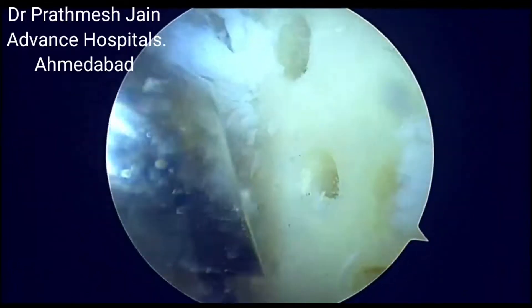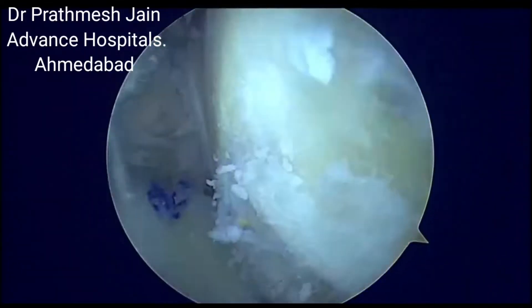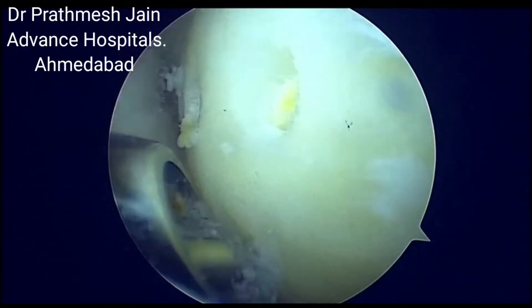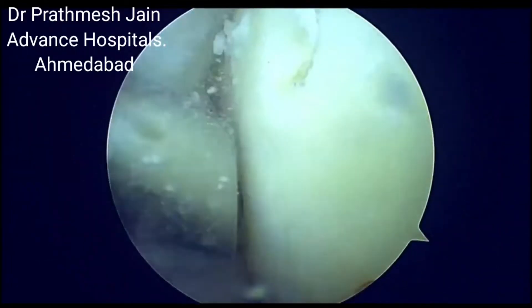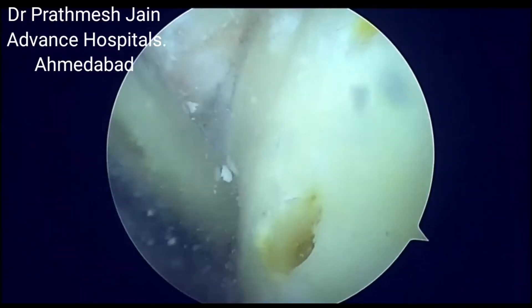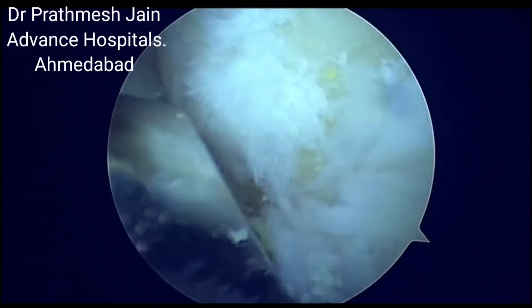This is an example of doing microfracture using the Striker special blade. What we are doing here is making small drill holes by the use of a mechanized shaver drill, so that there is good healing of the fibrocartilage in the area of the exposed bone.